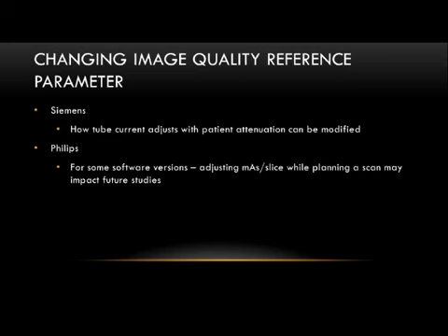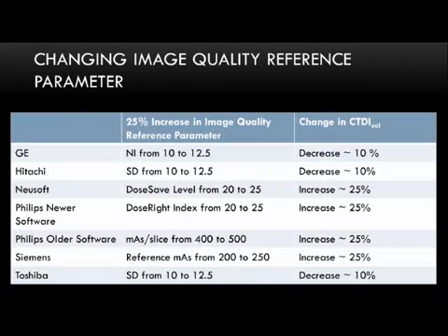Let's say for the larger patients, I'm willing to let that slope go down a little bit to not increase the tube current quite as much, even though patient attenuation is going way up. And then you might also say, similarly, as patient attenuation goes down, I actually want to increase the change in the tube current more down there, because smaller patients, smaller anatomy, you might need different noise characteristics down there. So that's one important thing to keep in mind with those.